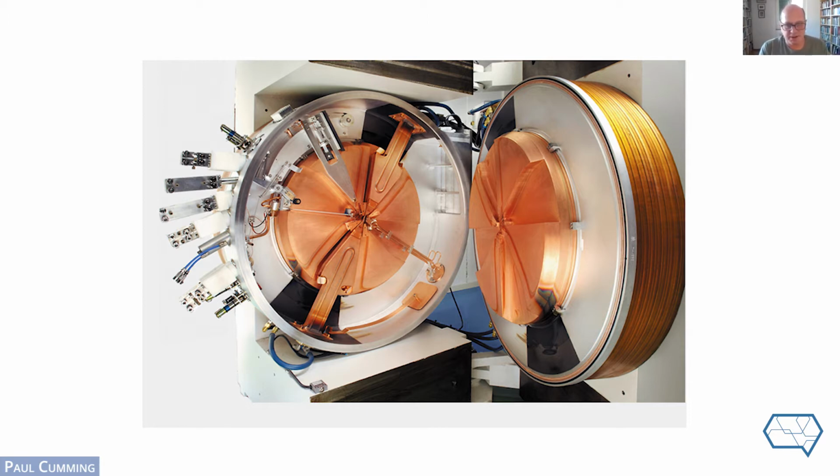This is a modern cyclotron. It really shows the same principle, but this is a medical cyclotron specifically used for accelerating particles, protons in general, to generate synthetic radionuclides to be used for molecular imaging, such as PET. And you see, it's not that unlike Lawrence's instrument, except it's much bigger, but it has these copper segments inside that apply the oscillating electric field. And you see around the instrument, there are exit channels or targets, which are really very much like in Lawrence's prototype from 1937, I think it was.